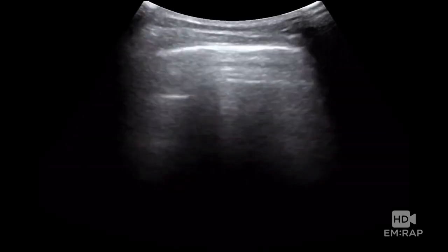Now, for it to be considered a B line, it's got to be vertical. It's got to extend from the pleural line all the way down to the bottom of the ultrasound image, and it has to move with respirations. Sonographic B lines have the same meaning as the curly B lines that you see on chest x-ray when you have pulmonary edema.